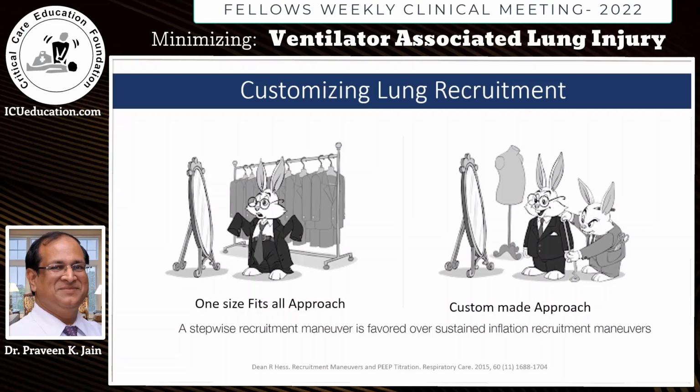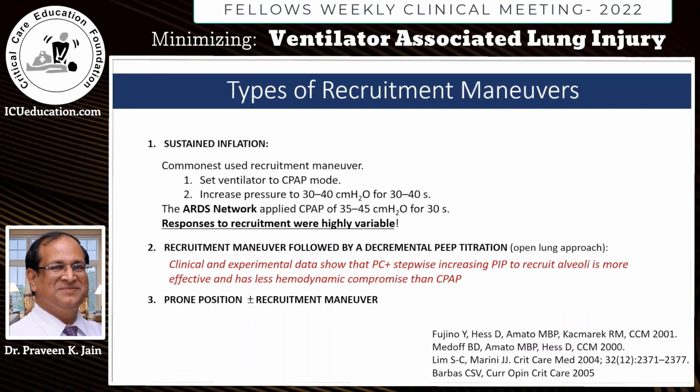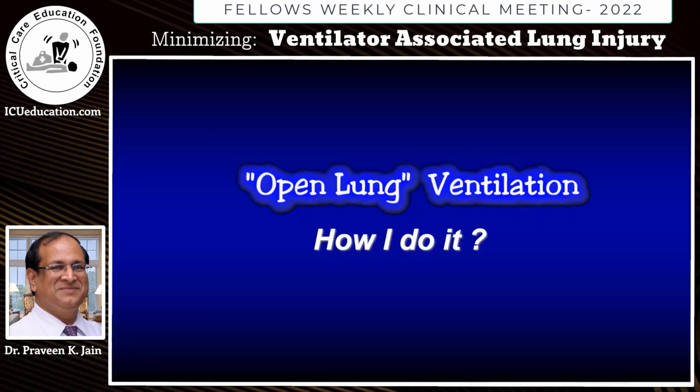What we need is a custom-made approach where a stepwise recruitment maneuver is done. Clinical and experimental data has shown that a pressure-controlled approach with stepwise increase in peak inspiratory pressure to recruit the alveoli is not only more effective but has less hemodynamic compromise than using CPAP. How do I open the lungs?